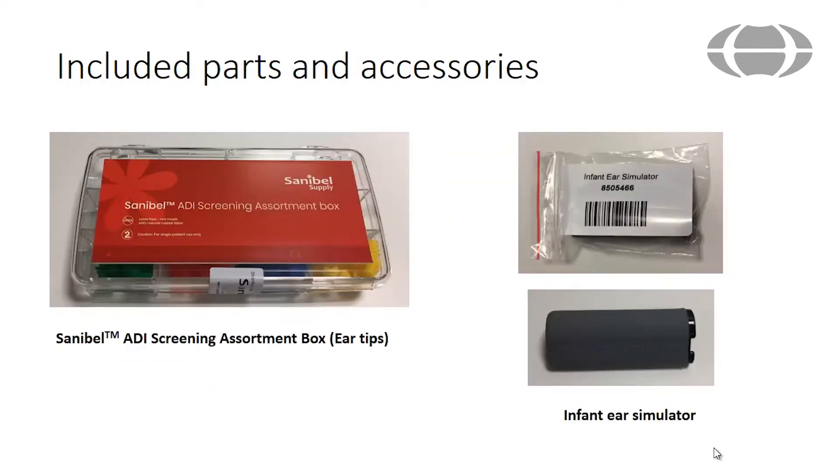The Sanibel ADI screening assortment box includes a variety of ear tips that you will place on the probe before placing it in the patient's ear. The infant ear simulator is provided and is used for performing a daily system or probe test.